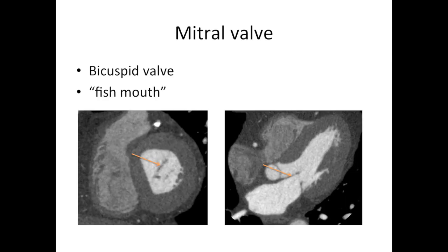The next valve as you pass through the heart is the mitral valve. This is the left atrioventricular valve and it has what's called a fish mouth appearance on short axis imaging — that wide oval opening — and you can see it on the CT scan and the axial pictures as well.